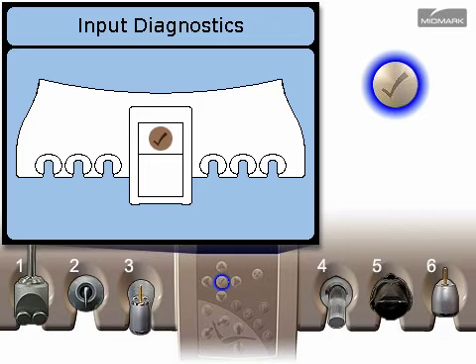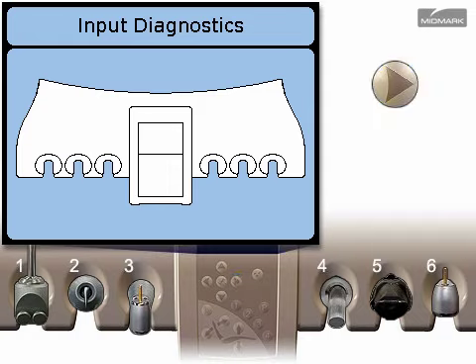Press any button on the control pad and a symbol of it will appear on the display graphic. This includes chair control buttons and flex arm brake sensors. If a symbol does not appear, the button is not working properly.